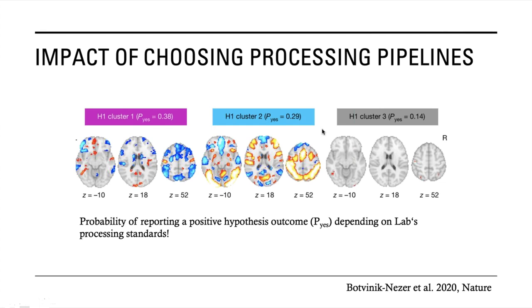And therefore, standard and really high quality processing pipelines are needed that everybody can refer to, and to establish a common framework for processing and for analyzing data, to get a better glimpse of the underlying ground truth every lab wants to investigate. For sure, adaptations are possible and important, because each data set is different, and therefore processing pipelines cannot be applied directly to each set of data. There is no process button, but at least a framework, or the fact that this processing affects your data immensely is really important to know.